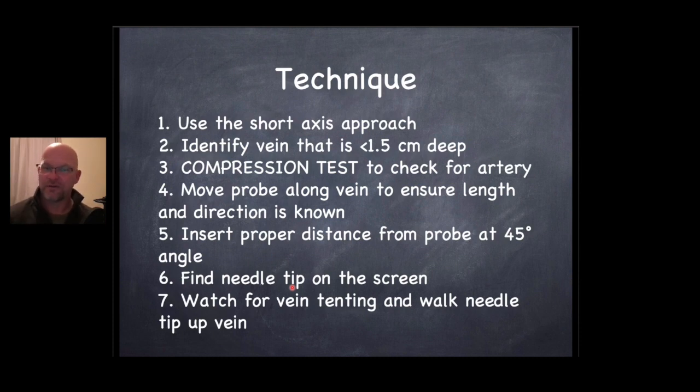Some patients it's very hard to find your needle tip, and that's not just body habitus. I don't know if it's how they store their minerals. I don't know. I've seen large people and skinny people where it's difficult to find my needle tip inside of them. So I don't know what changes that. Sometimes there are power settings you can adjust on the particular ultrasound that you're using.